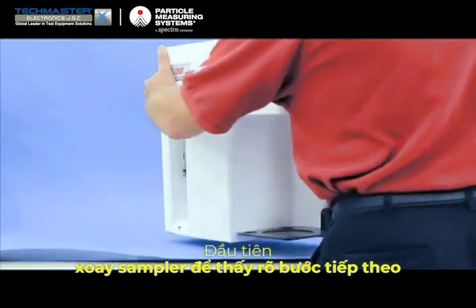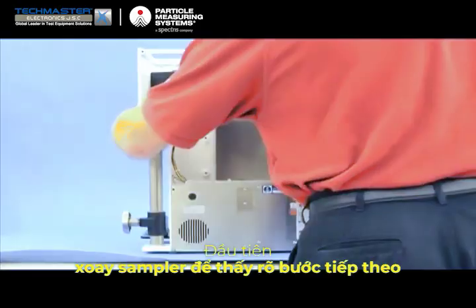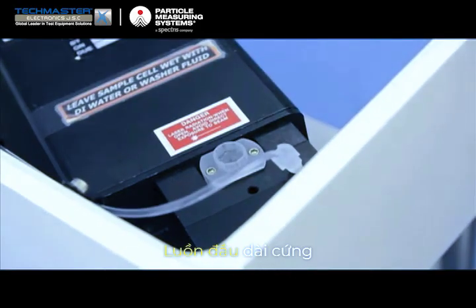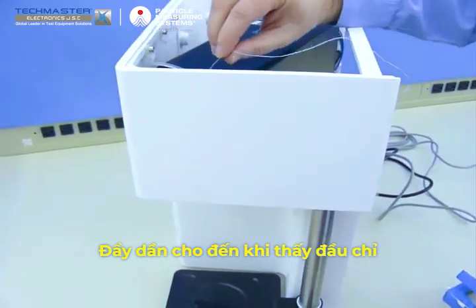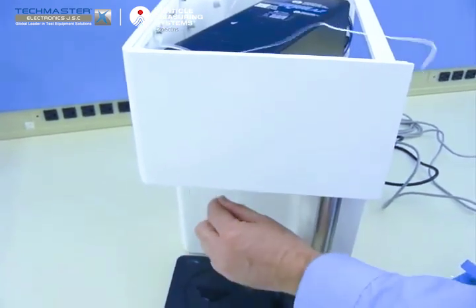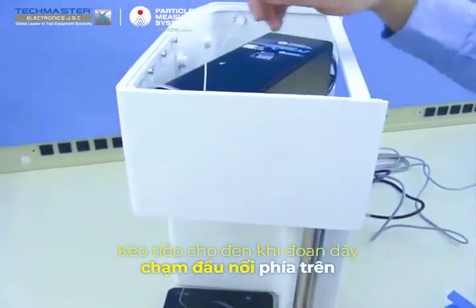First, I will turn the sampler around so you can see the next step, which is to thread the floss through the capillary. Feed the long compressed end we identified earlier into the top capillary fitting. Keep feeding it through until you see it begin to exit the lower fitting on the sampler chassis. Pull it through until the fat section reaches the top capillary fitting.